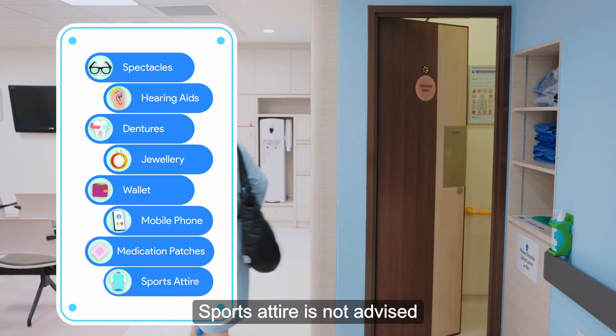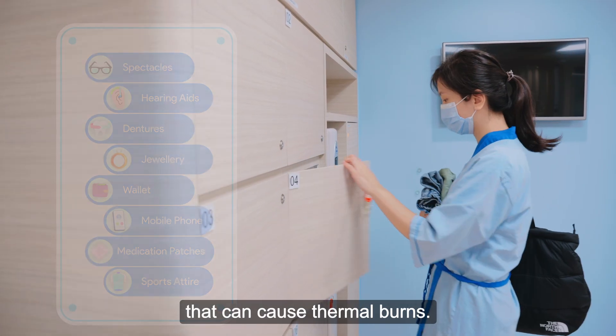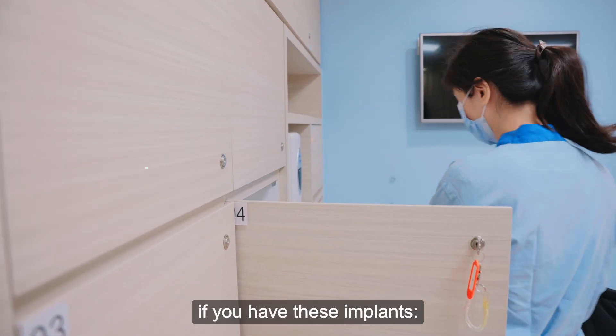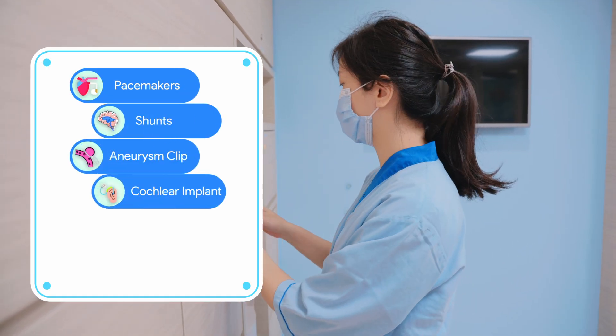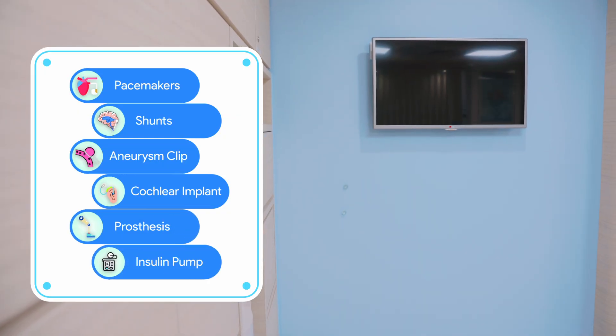Sport attire is not advised as it may contain metallic microfibers that can cause thermal burns. Please inform the radiographer if you have these implants: pacemaker, shunts, aneurysm clip, cochlear implant, prosthesis or artificial implant, or insulin pump.